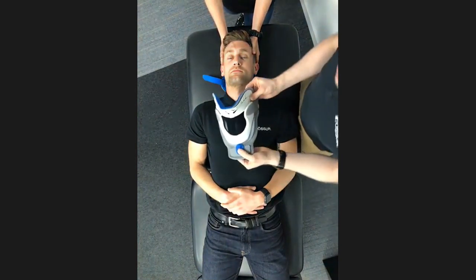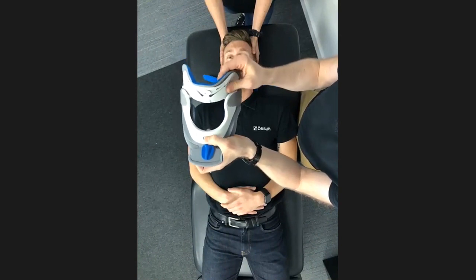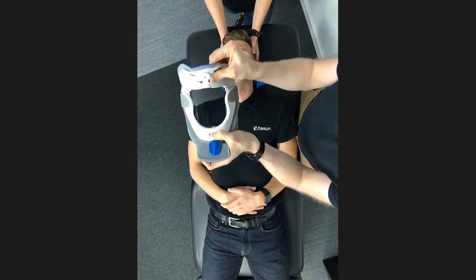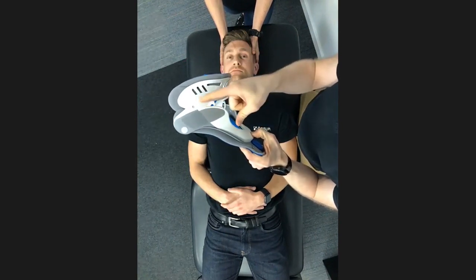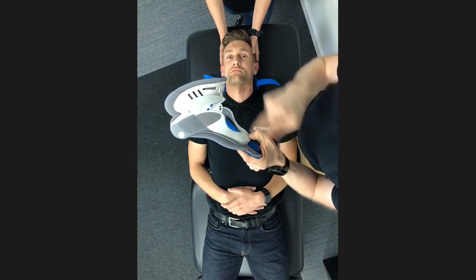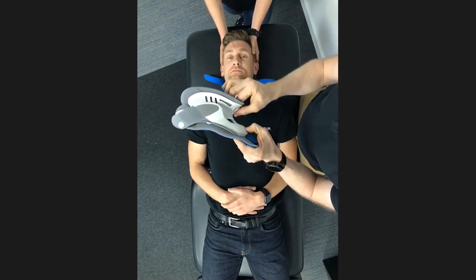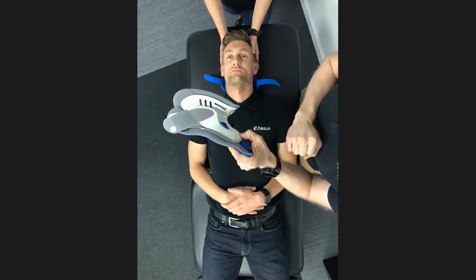The next thing we need to do is adjust the collar according to the size that we would need. So what we can actually do is adjust the height, and you can see those 7 height settings that are down here. It's difficult to see because they're sort of in white, but we can adjust this very quickly and very easily according to whatever we need.